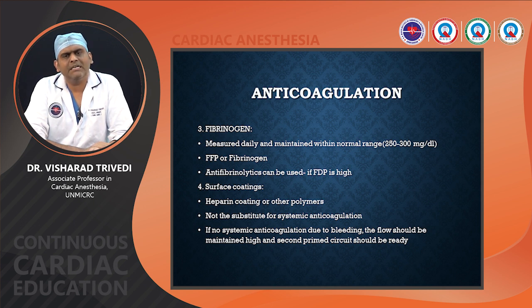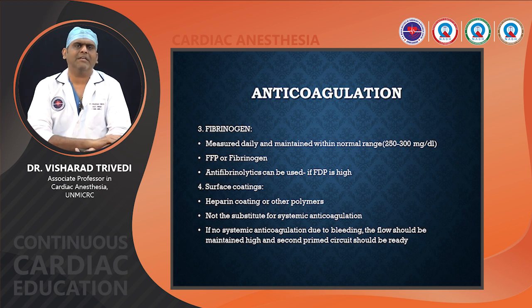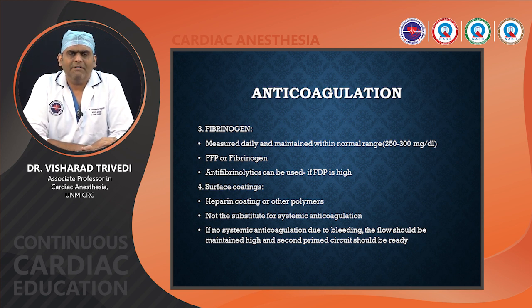Surface coatings may be used with the newer available circuits, in which there is a coating of heparin or other polymers like heparin and chondroitin, which is not a substitute for anticoagulation. You have to give heparin also. If at all you are using a heparin coated circuit, then also you have to give heparin.